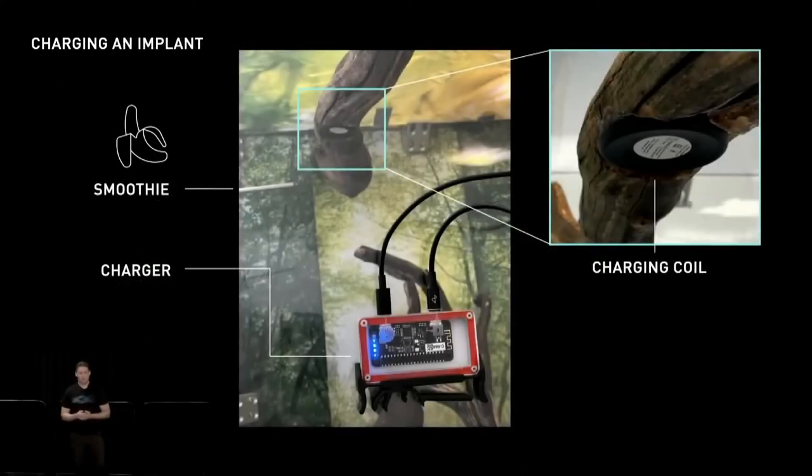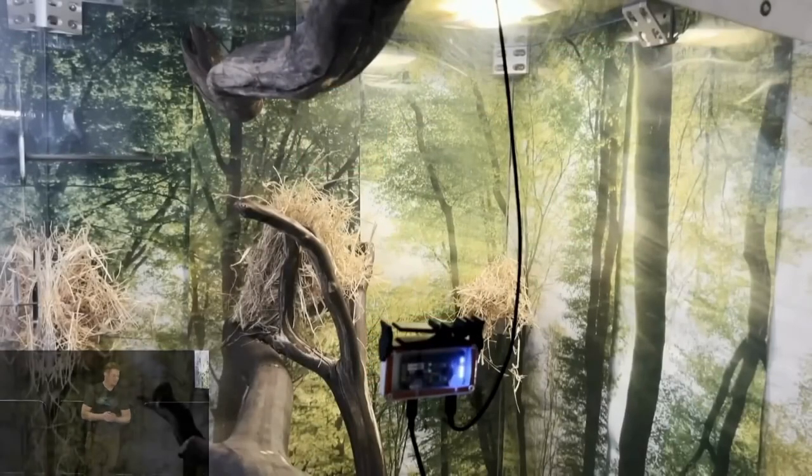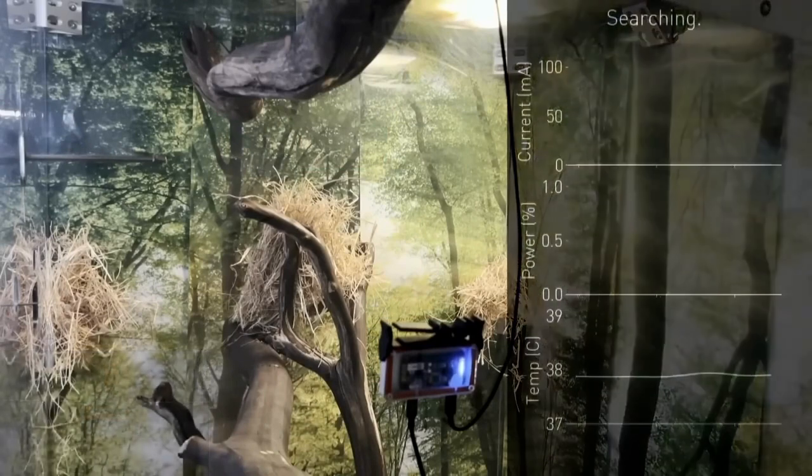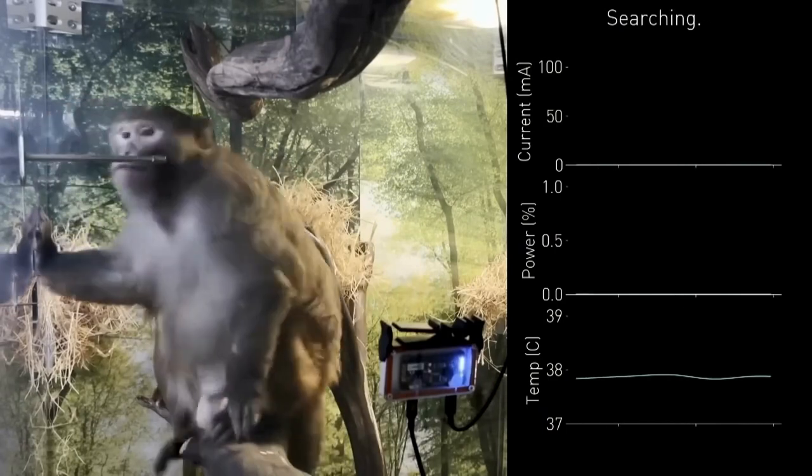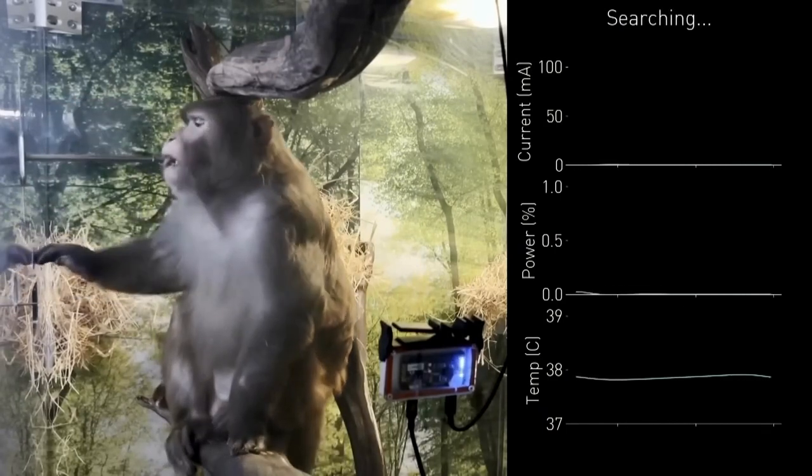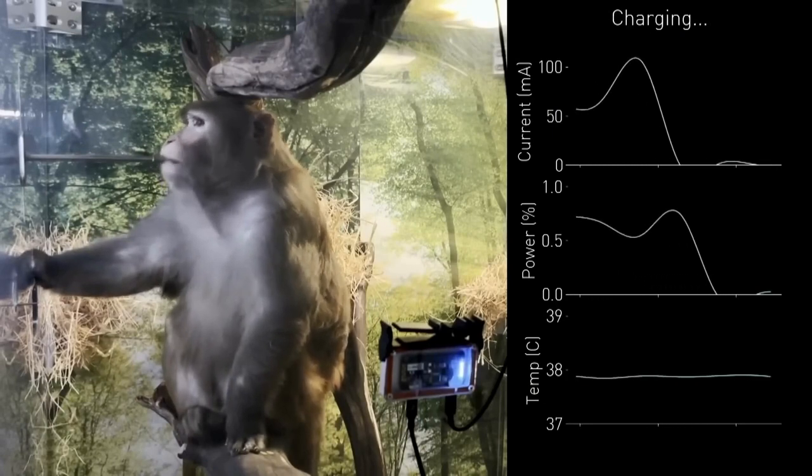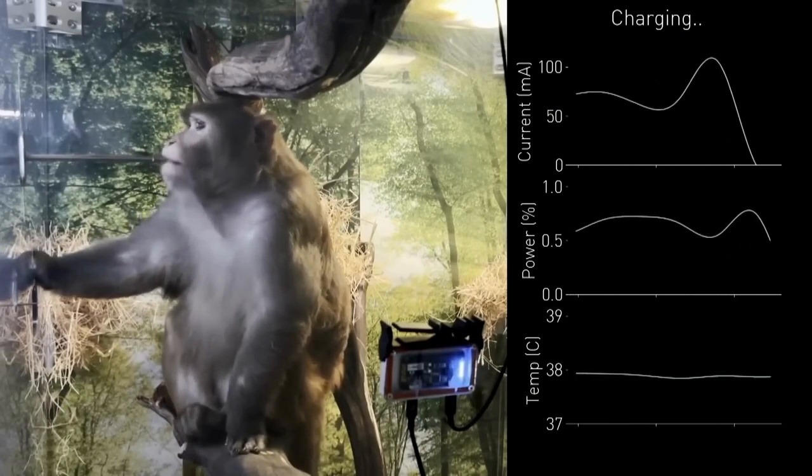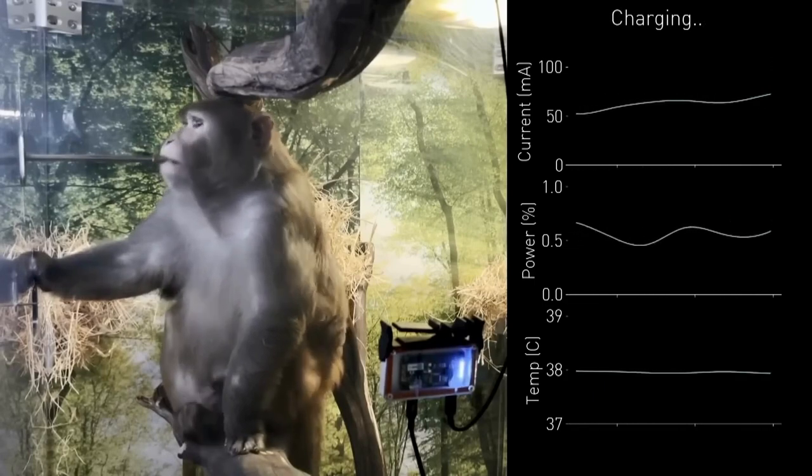With the addition of one new outer control loop plus a banana smoothie pump, the troop has been trained to charge themselves. So let's see how Pager charges his implant. On the right, we're streaming real-time diagnostics from Pager's N1. When he climbs up and sits below the coil, you can see the charger automatically detect his presence and transition from searching to charging. We see the regulated power output on a scale of 0 to 1 and the current driven into his battery.